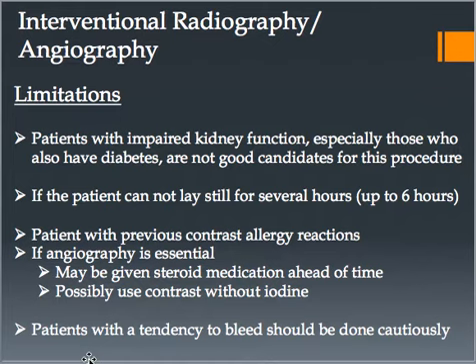And then also any kind of catheter angiography procedure should be done very cautiously or not at all on patients that have a tendency to bleed, because obviously if they tend to bleed, we don't want to go in there with the catheter and then cause more bleeding.